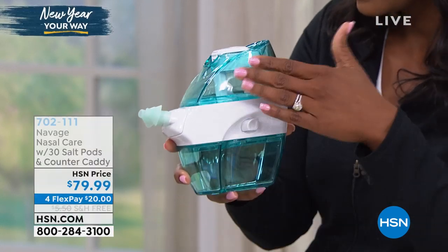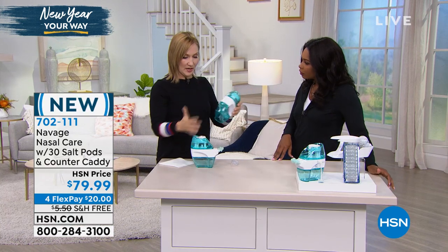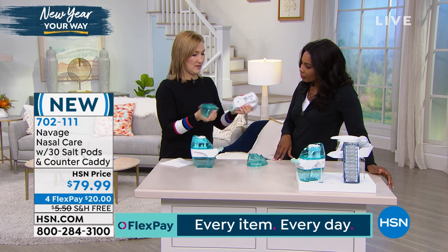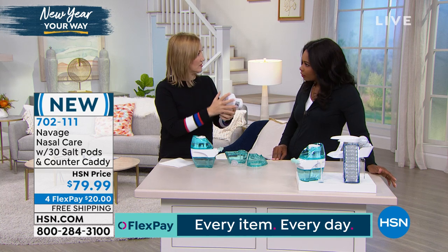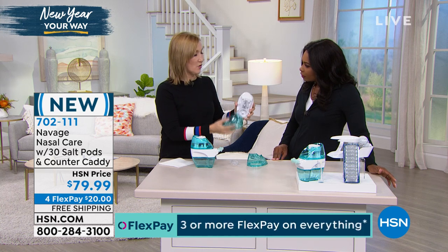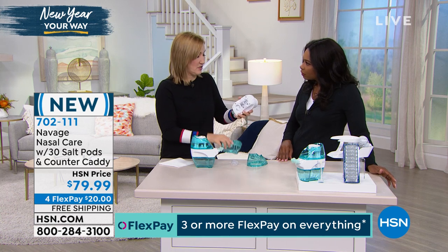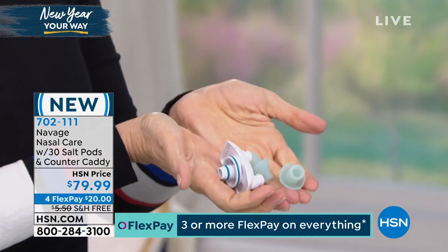I want to talk about cleaning too — how do I clean this? It's super easy. After you use it, this one is now nice and open. You just pop this off, pop this off, and then rinse. And if you want to go deeper, you can soak them occasionally in a little vinegar and dishwashing soap. This pops off and you can even take the nose pillows off — the whole thing comes apart.